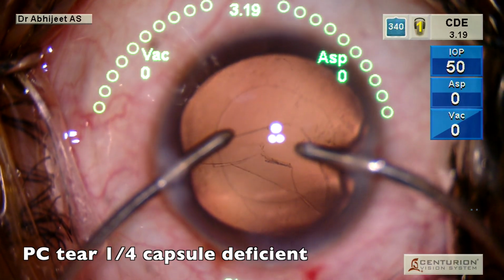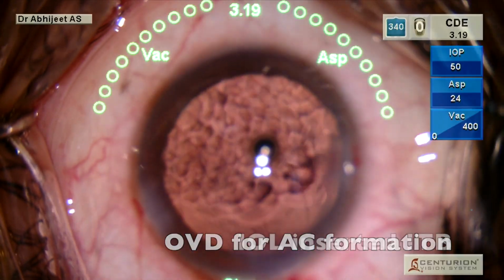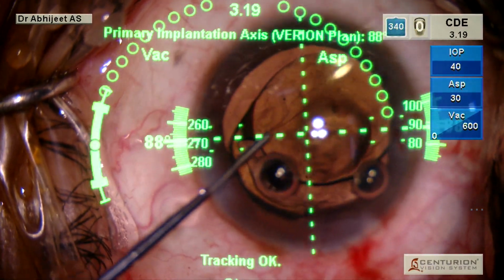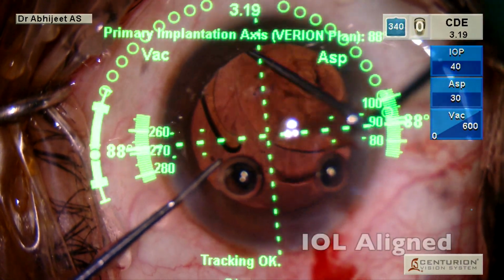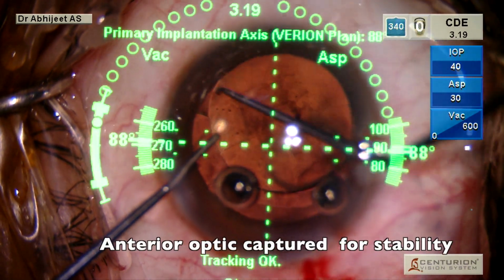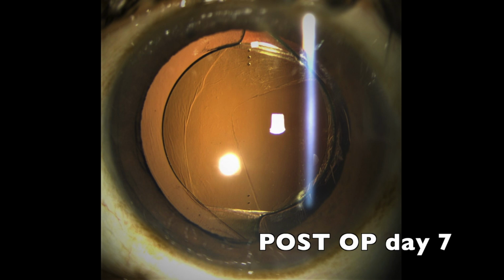Here we have a defect which is nearly 1/4 of the PC not being available for the support of the IOL, and now what are we going to do? We insert the IOL, we let the IOL open up in the chamber, not directly into the bag, and then slowly manipulate these haptics in the area wherein the PC is intact. And once we've done that, we align the IOL and then lift the IOL up to have an anterior optic capture.